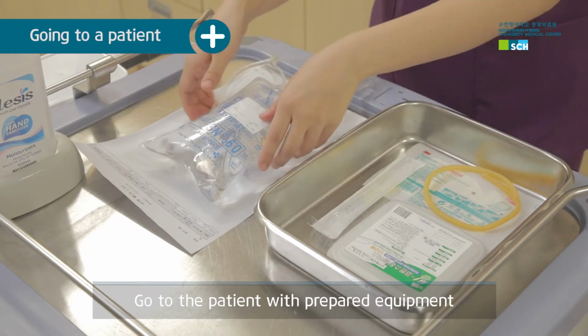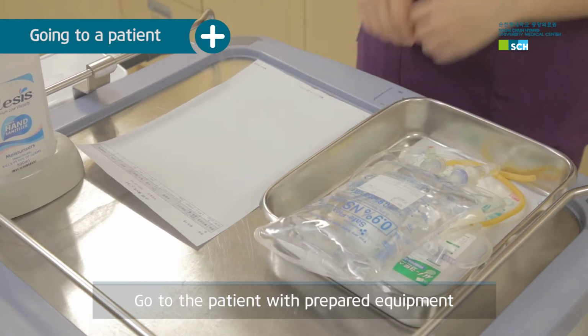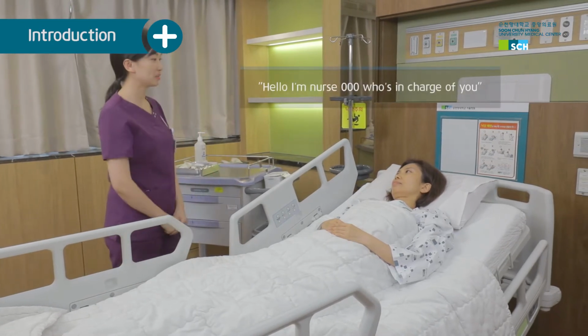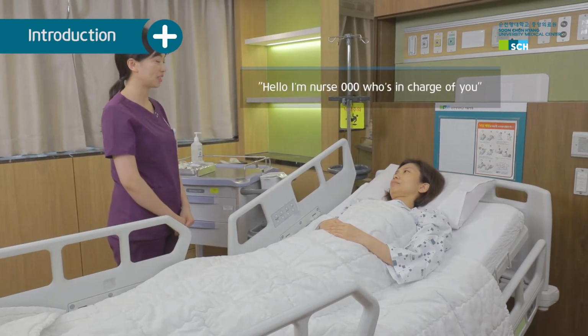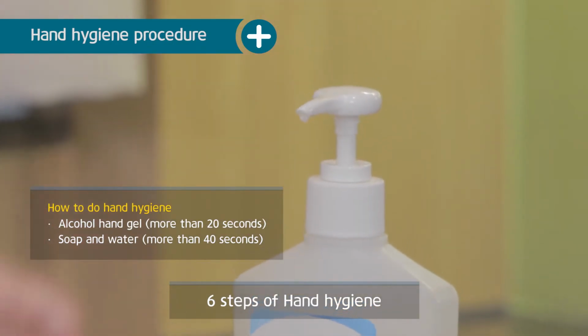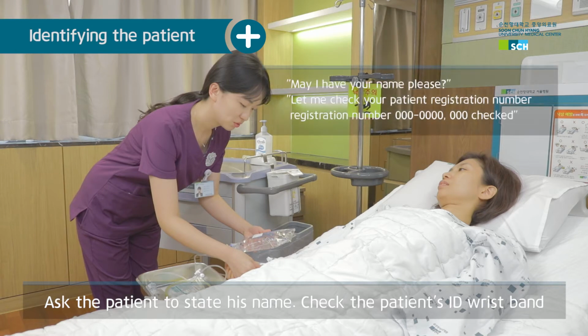Go to the patient lying on the bed with prepared equipment. Introduce yourself to the patient. Perform hand hygiene. Identify the patient by asking the patient to state his name.